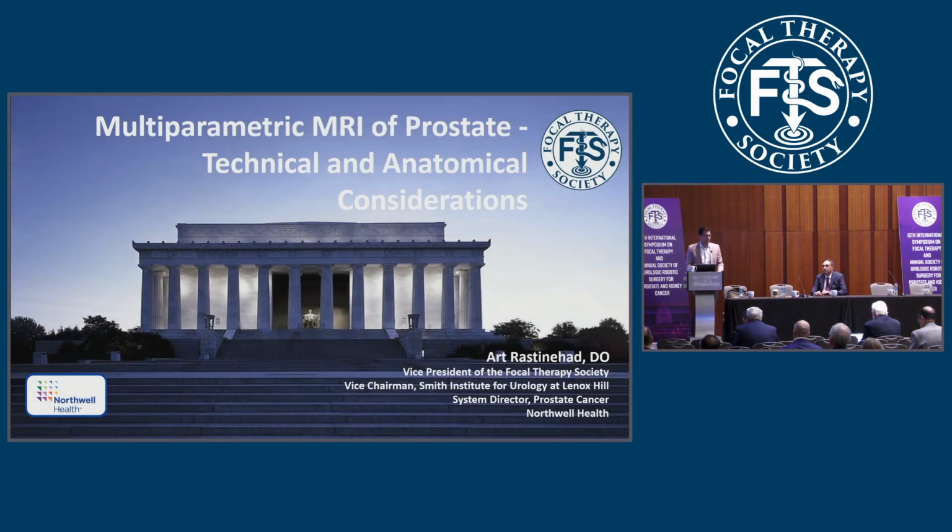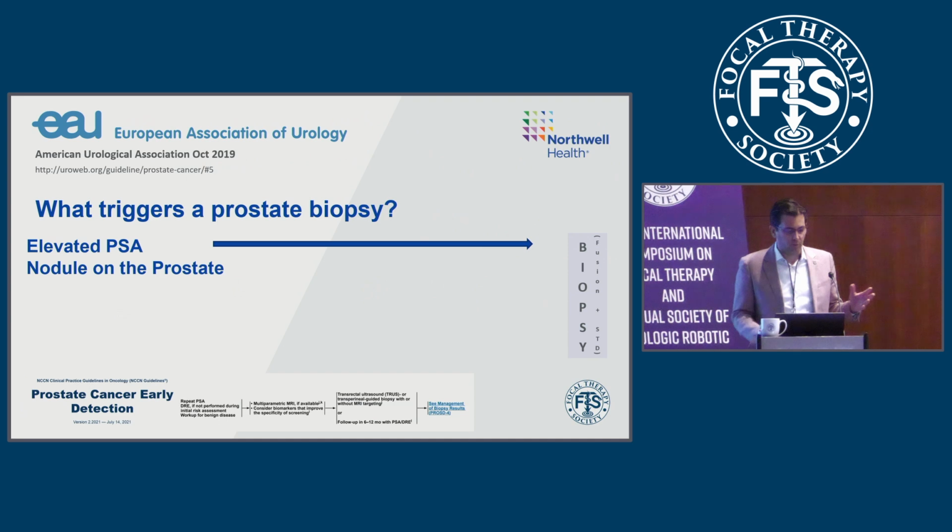All right, welcome. This is the second part of the session. We're going to shift gears a little bit from interpretation to understanding some of the data associated with it, and when should you order an MRI.